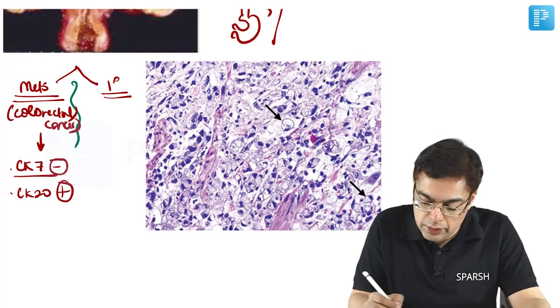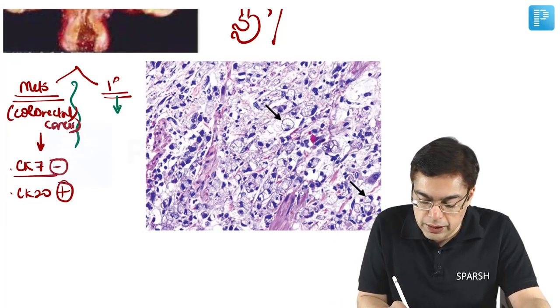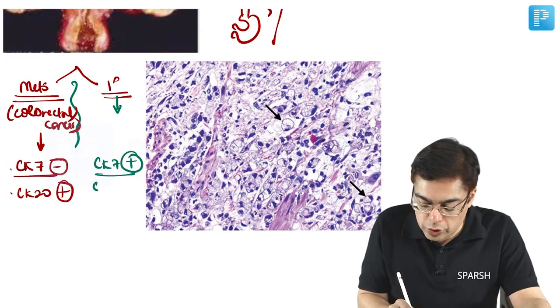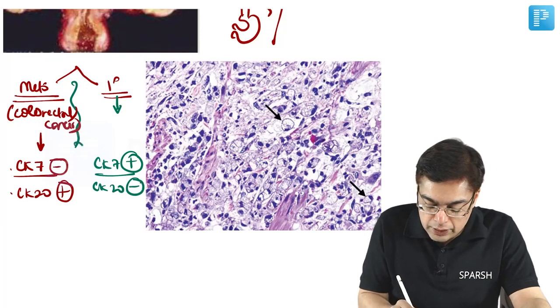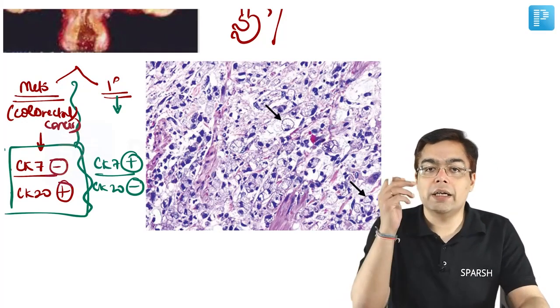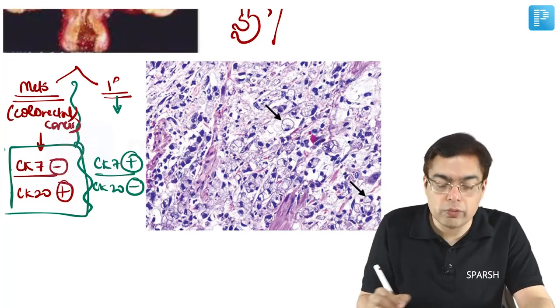On the other hand, as and when we are making a mention of something like the primary ovarian tumor, say for example something like the ovarian fibroma that we have just made a mention of, adenoma, do excuse me on that, then that is going to be having a positivity of CK7 and that is going to be negative for CK20. So that CK7 CK20 table, which we use quite commonly for identification of carcinoma of the unknown primary, is going to be useful and coming handy over here as well.